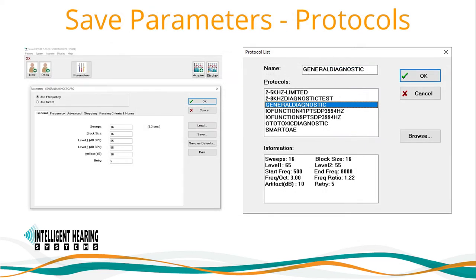Once all parameters have been set, save the protocol file via the Save button and name your protocol file. If you wish to load a previously saved protocol, simply click on the Load button to view and select from the list of available protocols.